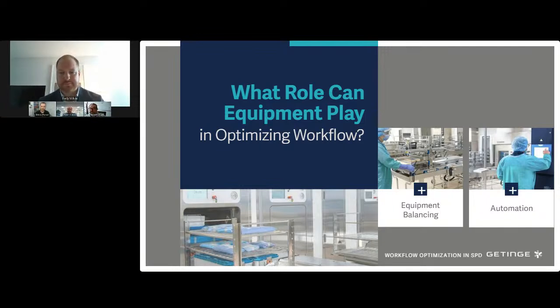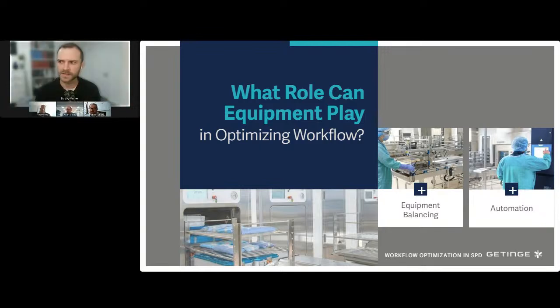Yeah, absolutely. And I like that, kind of using automation as a magnifying glass. Like if we rush to automate a bad process, it's just going to make things worse. But it can be really valuable in terms of saving steps. And I think that's where people are coming from with building the castle of rigid containers, that they think, I'm saving human motion. I'm not taking as many steps. And so I'm getting more work done in the day. And if you only zoom in with the microscopic lens of the number of instruments that one technician touched for the day, they might be right. Like, they might get through more work by using that method.